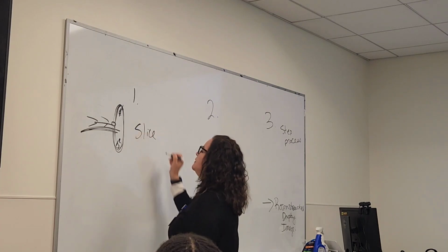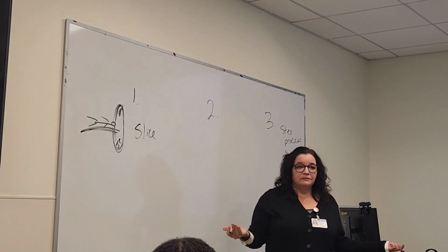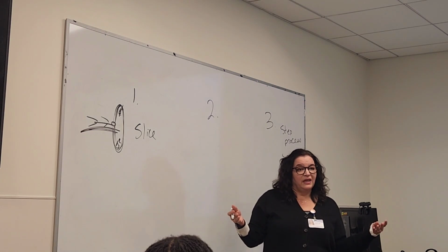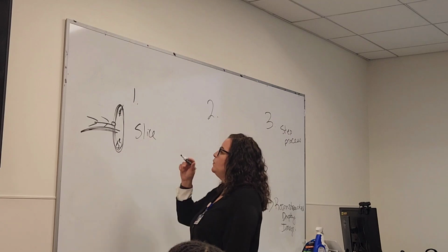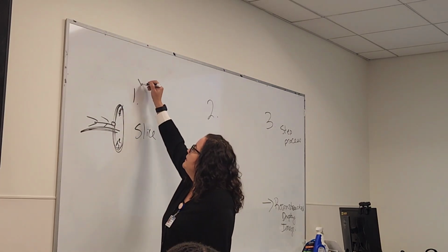Slices. So think about a sliced loaf of bread, right? We're going through slices. You eat the ends, you don't eat the ends, you like the middle because it's softer, whatever it is, it's slices. So how do we start to get the slices when we're thinking about X-ray?